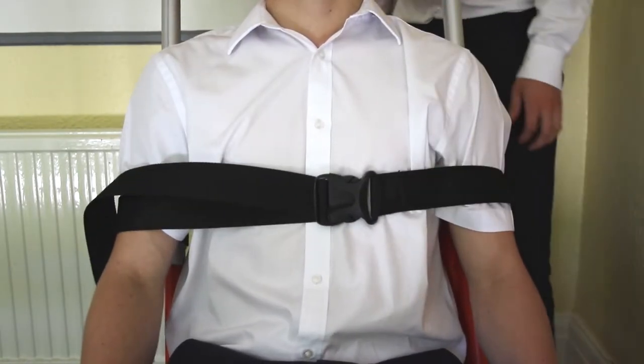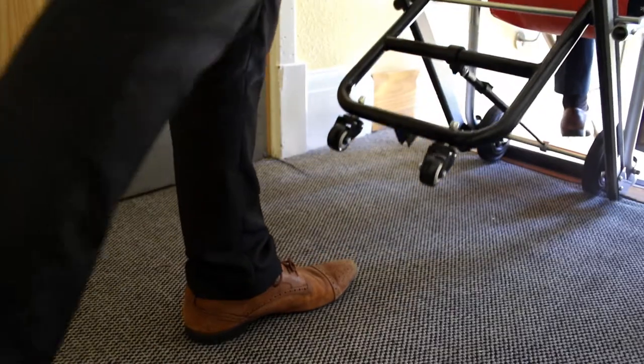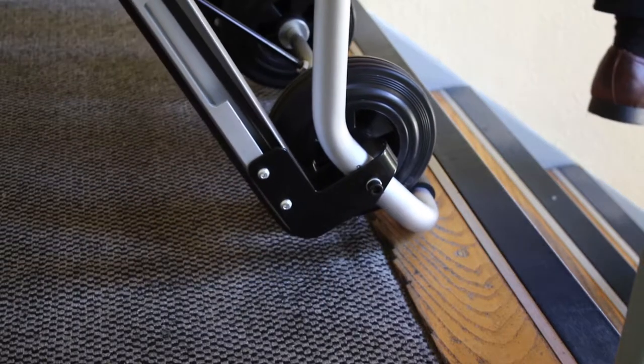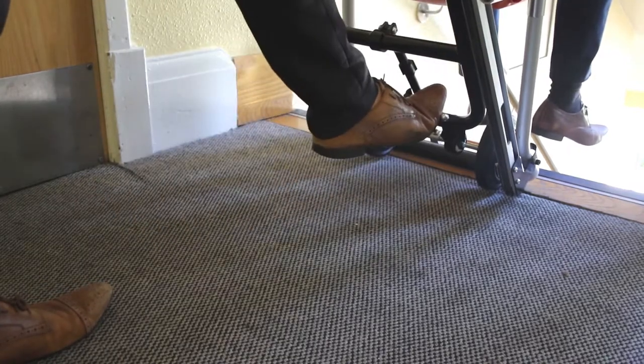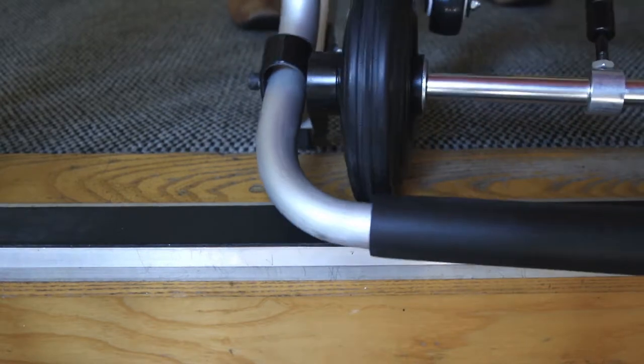In order to descend the stairs, wheel the passenger to the edge of the top step, ensuring that enough room is allowed to tilt the chair so that it can pivot on the front bar. When in this position, use one foot to stow away the rear stabilising wheels, ready for descent. Carefully walk the chair over the top step.